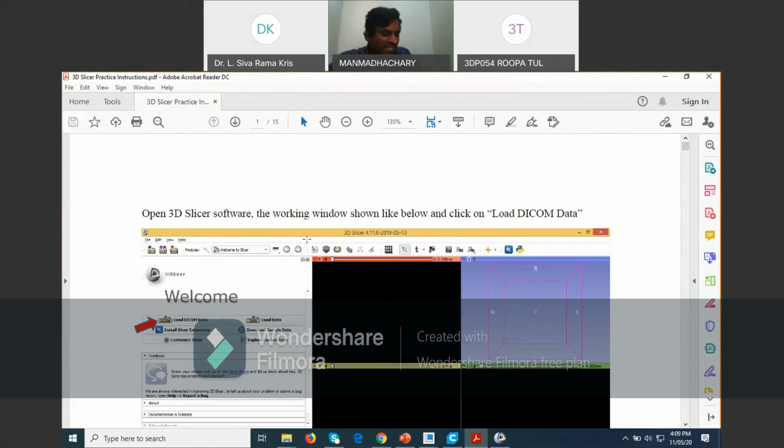Some participant is asking, sir, how to re-edit the model? Already you have developed the model, how to re-edit it? That is his question. Okay, for that, different software is required. Now in this one we can't do it. So you require different software. Can you name some of them? What software is required? Yeah, dedicated modeling software is required.